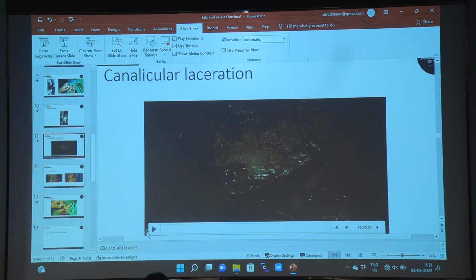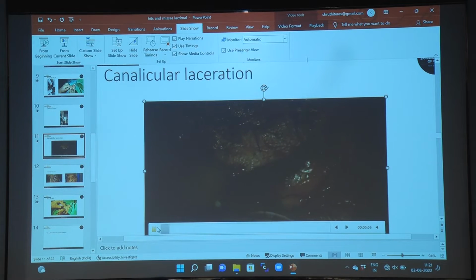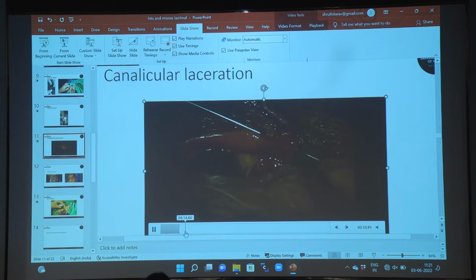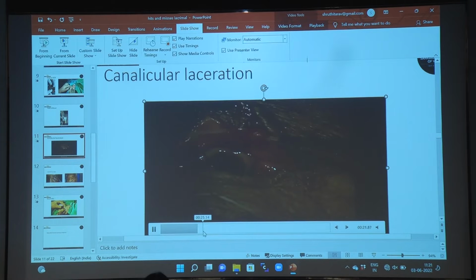Now, what about a patient like this who comes with a traumatic lid laceration repair done? So when you see a laceration of this kind and you see the canaliculus is torn, feel free to redo the procedure. A mini Monoka stent is passed. And you can see this, it's not very clear maybe, a pale cuff is there in the pink background. So that would be the other cut end of the canaliculus. So a mini Monoka stent is placed and a pericanalicular stitch is taken and closed.